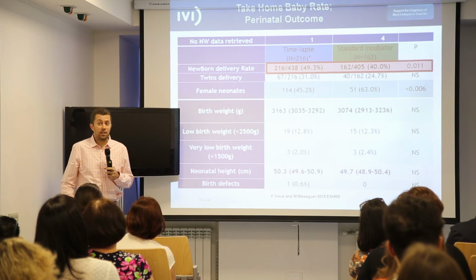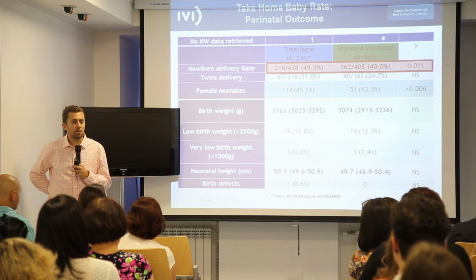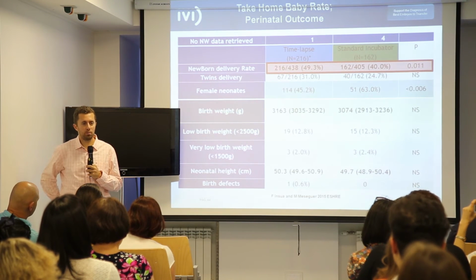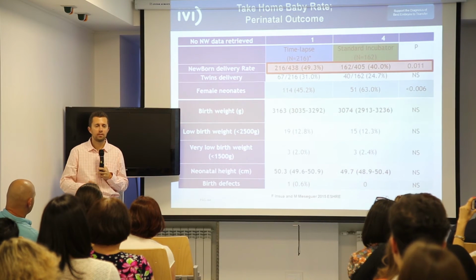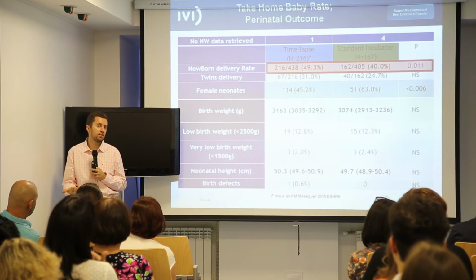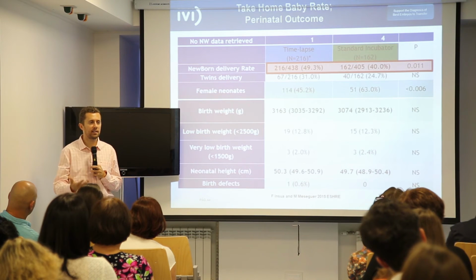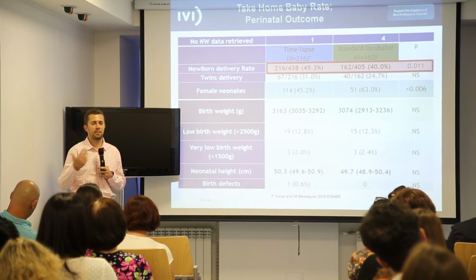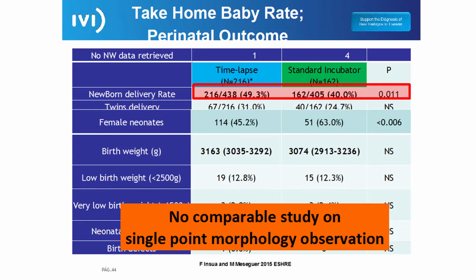But if you take a look at the outcome, and at the newborn delivery rate, the delivery rate in the time-lapse group is still 10% higher than in the control group. So we are getting data on delivery rate. And even the perinatal outcome, the obstetric outcome, is comparable between these two technologies. So apparently the time-lapse technology by itself does not increase the incidence of perinatal abnormalities. Just thinking about bad things of time lapse.